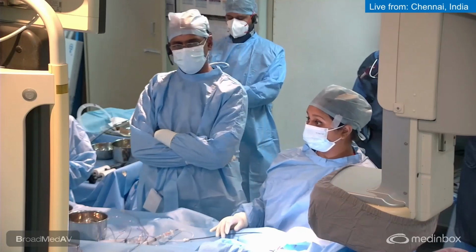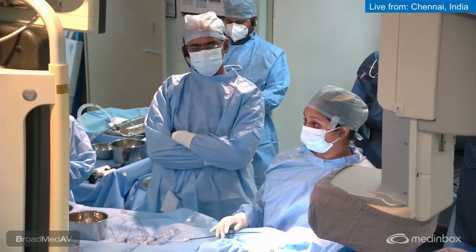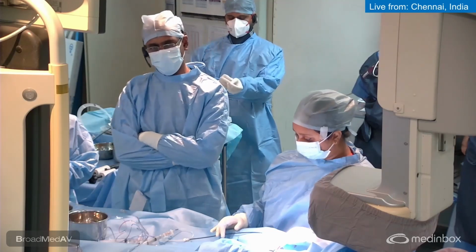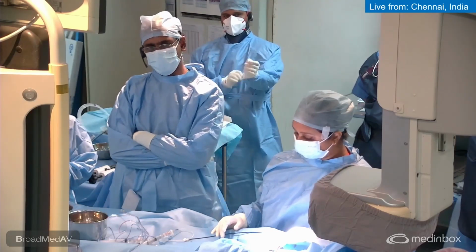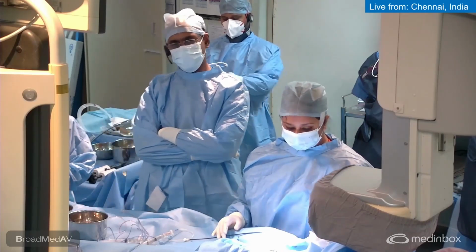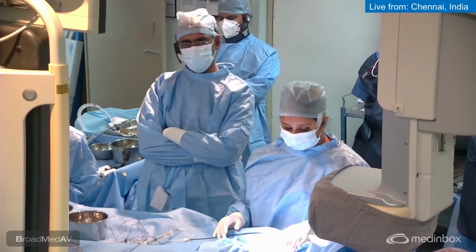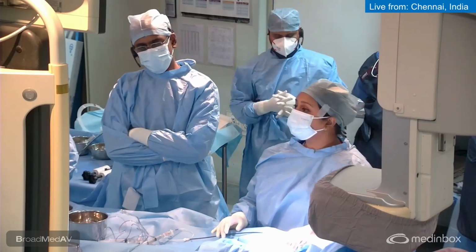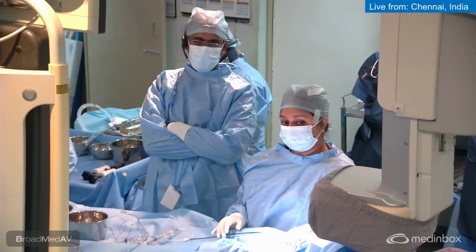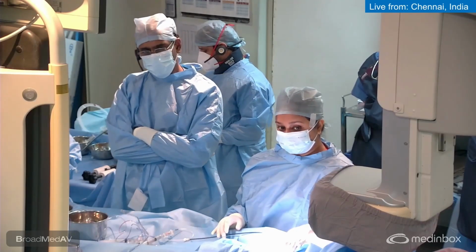The issue about stent angioplasty of the pulmonary artery will be, since there is a close relation between the ascending aorta and these branch pulmonary arteries, they carry a small risk of erosion of the stent from the pulmonary artery into the ascending aorta, causing an aortopulmonary fistula. Of course, we probably will not be aiming at enlarging it for a very large diameter.